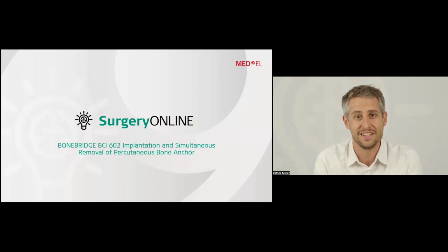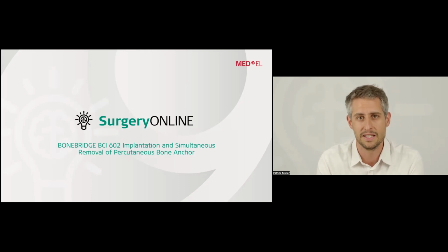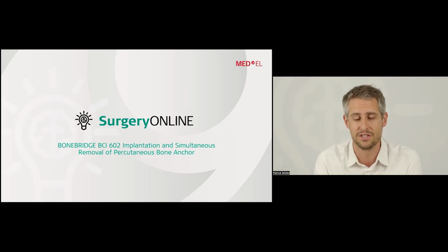We have an exciting topic here today for you, which is about bone conduction. And the name of the event today is Bonebridge BCI 602 implantation and simultaneous removal of percutaneous bone anchor. So this is a topic which gets more and more important nowadays as more and more patients would like to upgrade from a classical bone anchored bone conduction device to a more modern active transcutaneous device like the Bonebridge.